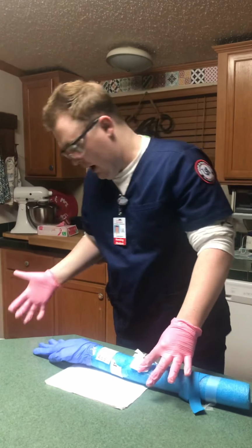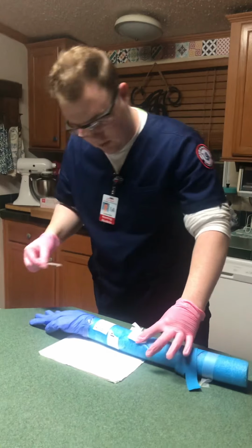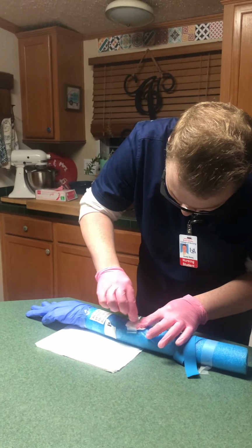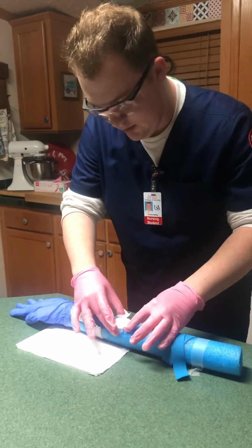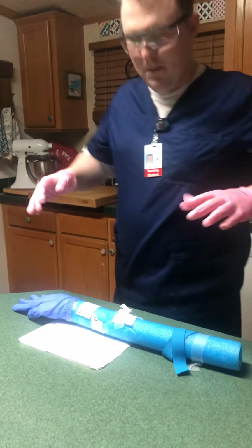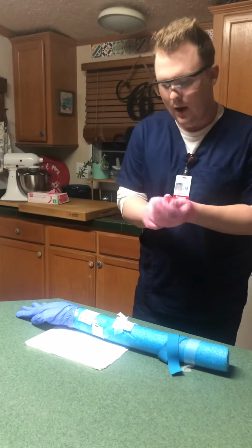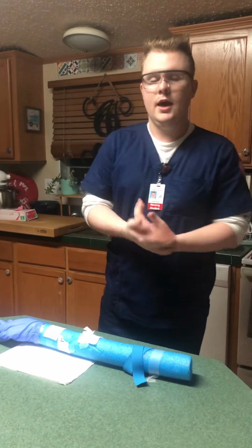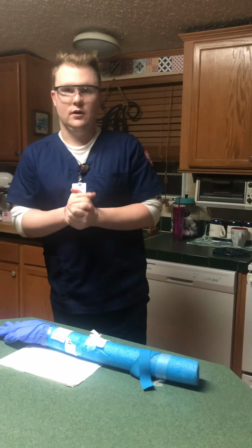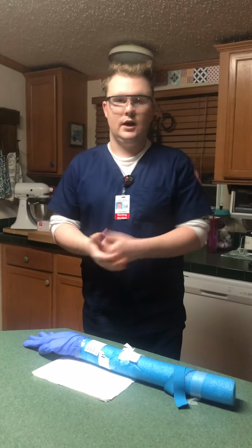So now that I have my new sterile gauze, I'm going to get my tape, and I'm going to tape it down and make sure that my patient is comfortable. So now what I would do after I have it in place is take my gloves off and perform hand hygiene, make sure my patient's comfortable, and I would document at the nurse's station. And this concludes my IV checkoff. Thank you.